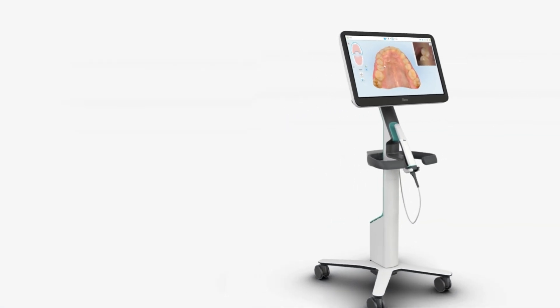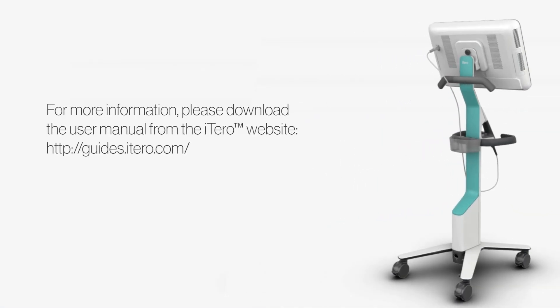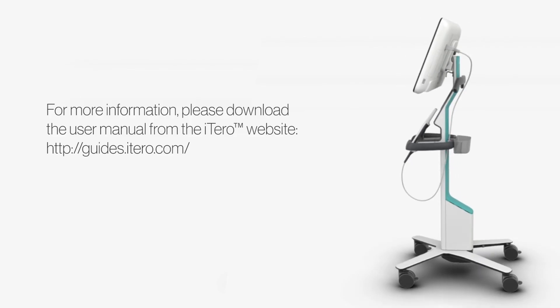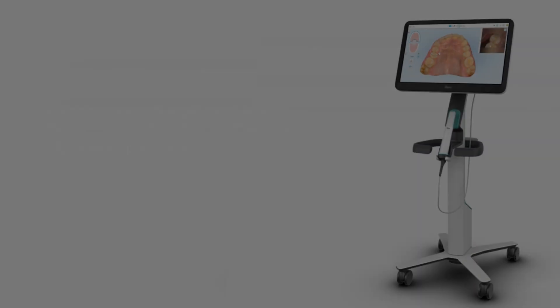For additional information please refer to the user manual on the iTero website or the electronic manual on your scanner.